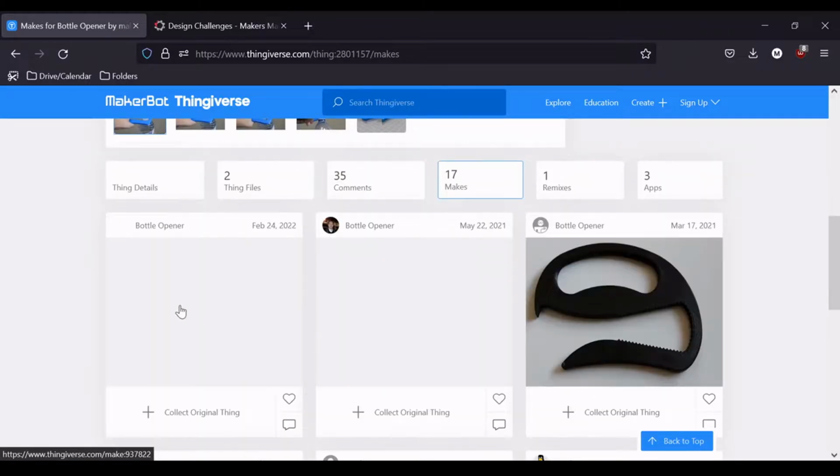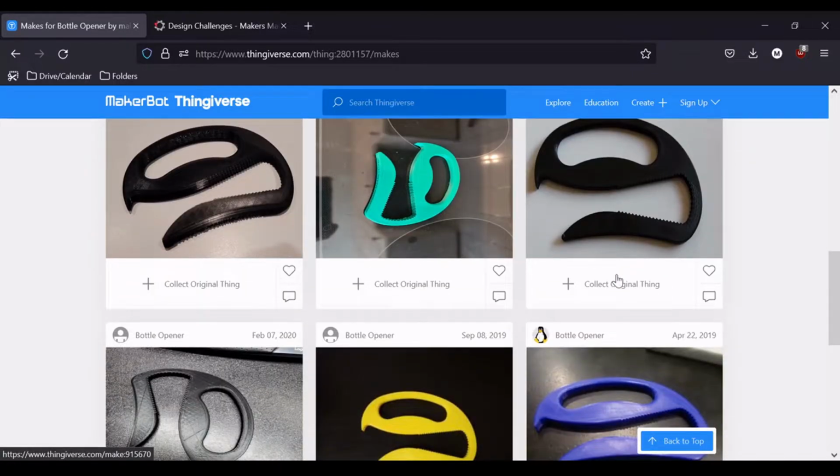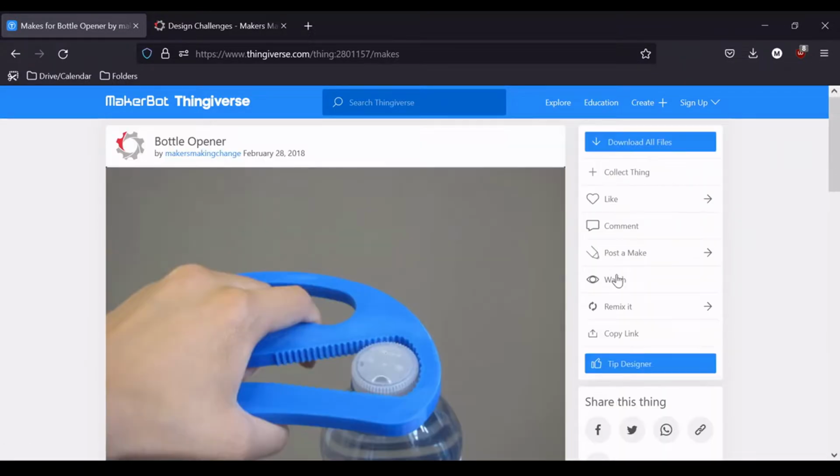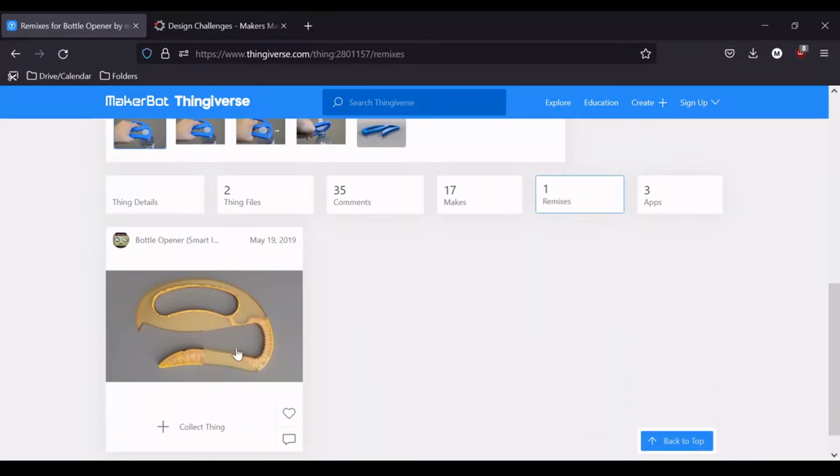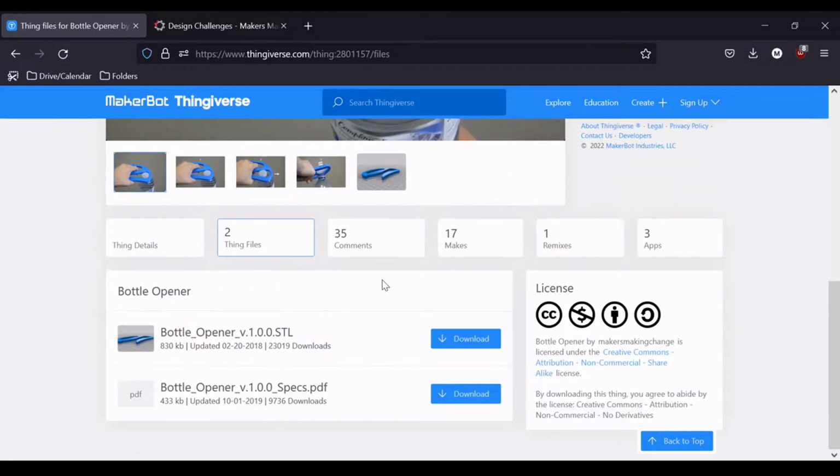You can also see other people that have made the project to just get an idea of what it's going to look like, as well as remixes, so changes that people have made to the existing design that might be better suited for your needs depending on what's in there.